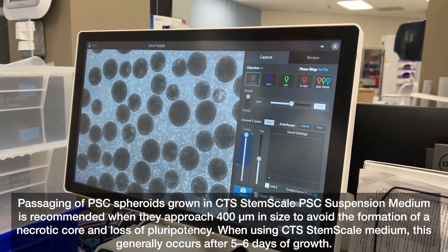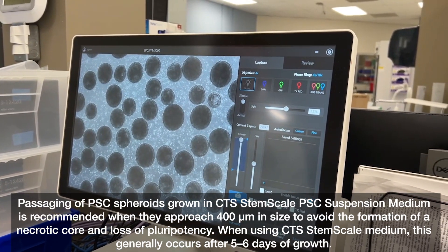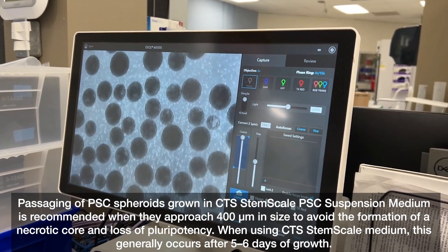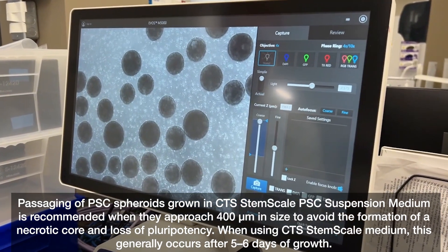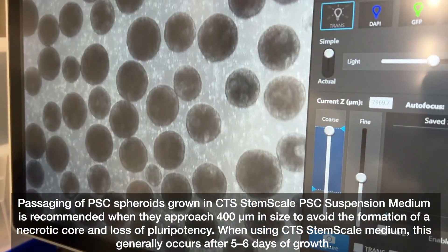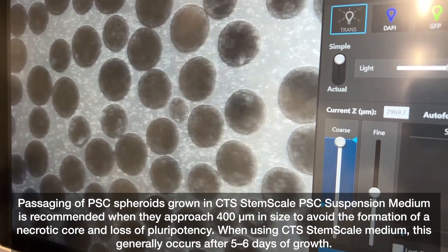Passaging of PSC spheroids grown in CTS StemScale PSC suspension medium is recommended when they approach 400 micrometers in size, to avoid the formation of a necrotic core and loss of pluripotency. When using CTS StemScale medium, this generally occurs after five to six days of growth.